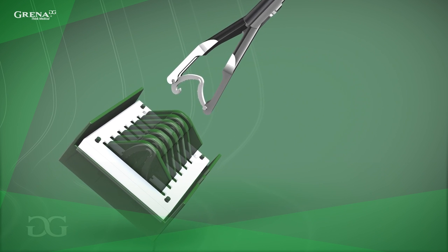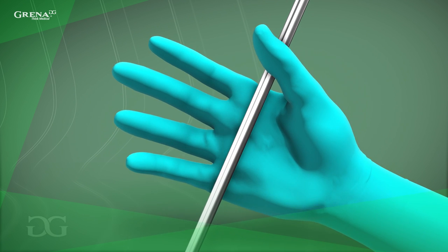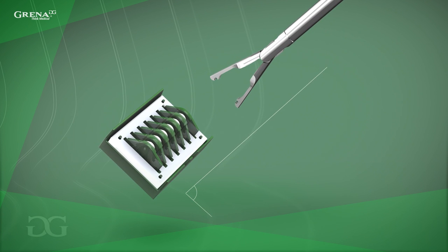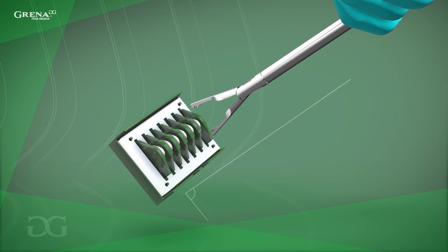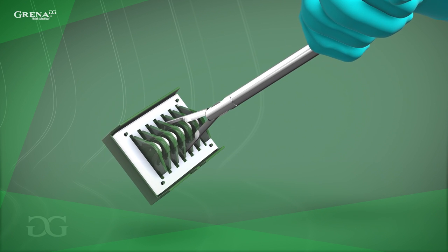This corresponds to the correct clip orientation after loading. Now, properly grip the applier shaft for easy and stable handling. Next, align the applier jaws vertically and laterally over a clip in the cartridge and advance the product jaws into the slot of the clip cartridge, making sure they are perpendicular to the surface of the cartridge. Advance the jaws until you hear an audible click.